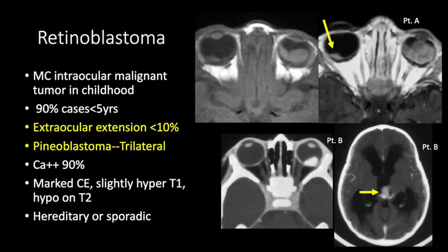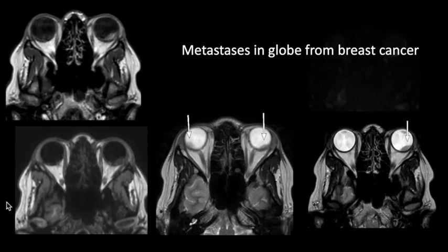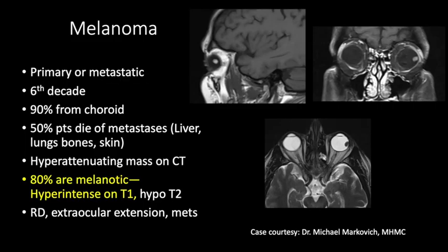Retinoblastoma may be hereditary or sporadic. Here we see a mass in the left globe and a smaller mass in the right globe — this was due to metastasis from breast cancer. Breast cancer metastasis can involve the globe or other orbital structures. Metastasis in the orbits can also be seen from lung primary, prostate, or other primary malignancies.